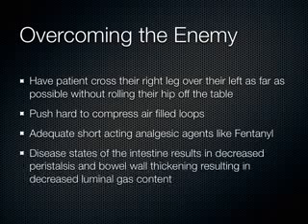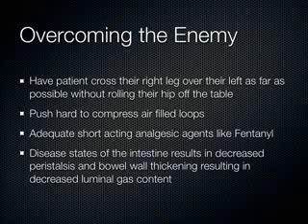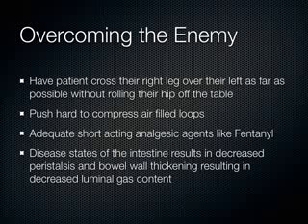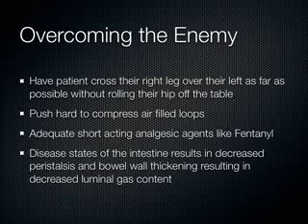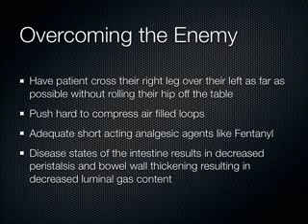It's a much more humane way to do it than what we're going to do today to our models. But the good news is, when you have disease states of the intestine, there's less peristalsis, there's bowel wall thickening, and there's less intraluminal gas, which makes abnormal intestine easier to see than normal intestine.